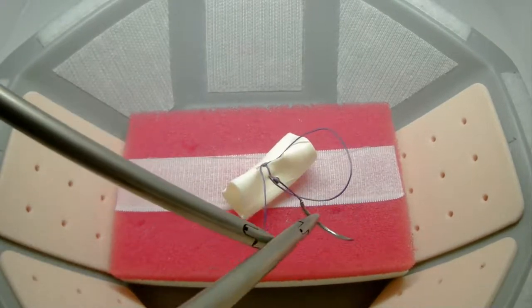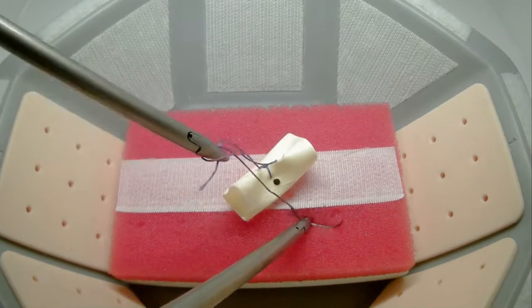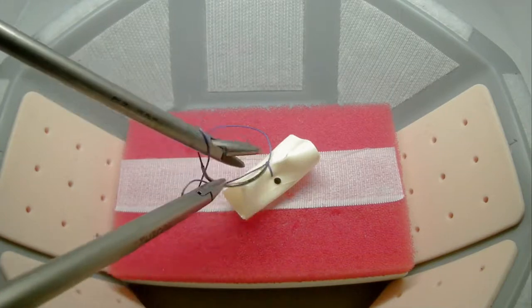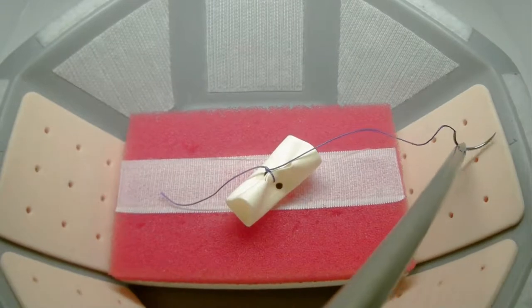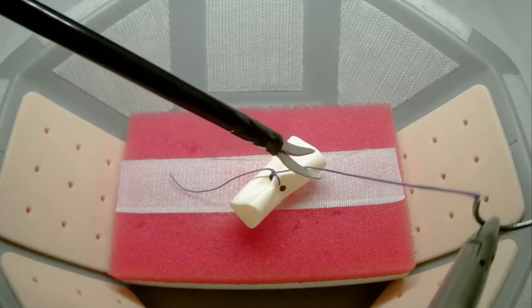You will follow that with two individual single throws. Once you have completed all of your throws, you will bring your laparoscopic scissors in and cut the needle end off of your completed knot.